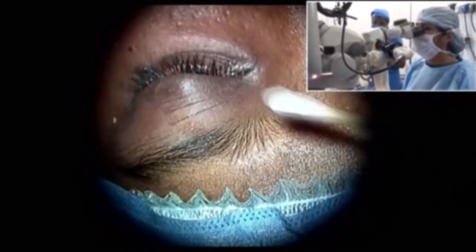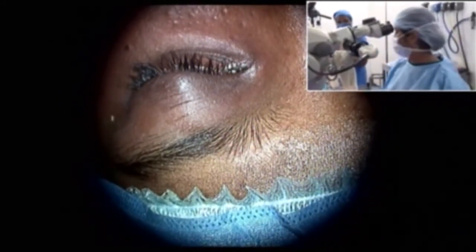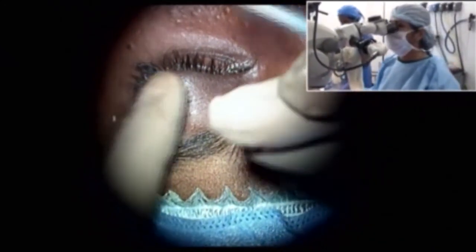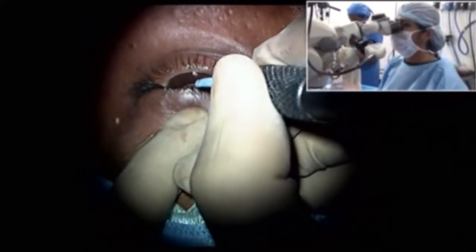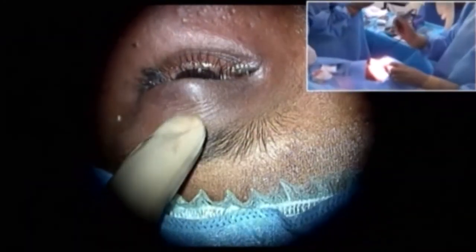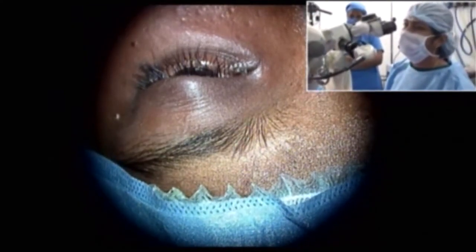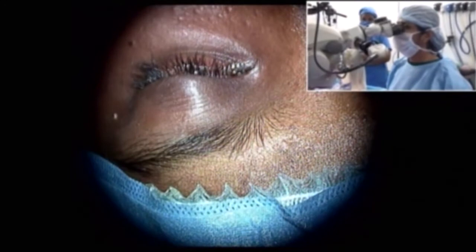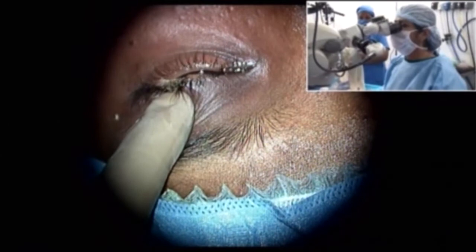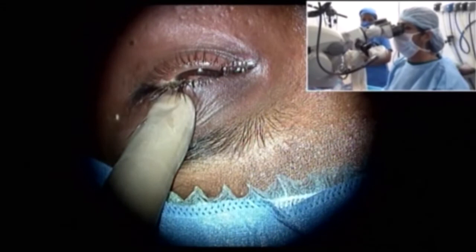Can you just tell us how you did it without losing any lashes? Can you just show your probe, the direction in which you passed? So it was exactly in this plane, just as we would shave. I would prefer to just not hold the lesion, but just make sure that it's properly exposed, and you just shave it off completely.